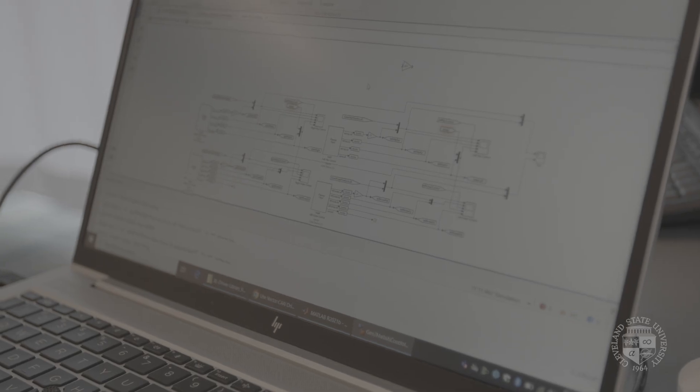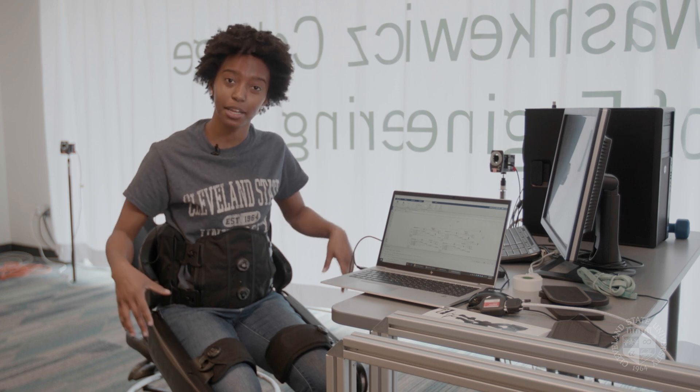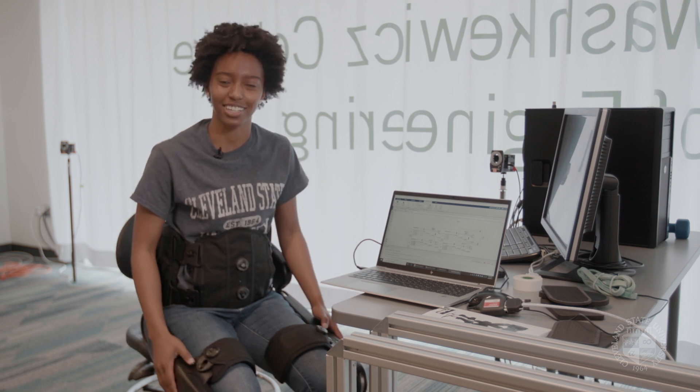Currently in the center we are working on the indigo exoskeleton. This is an exoskeleton used for lower limb patients who experience paralysis. Here's my code here. Typically you will be able to catch yourself if you fall but people who have paralysis aren't able to do that so that's what we're going to try to emulate within our exoskeleton.